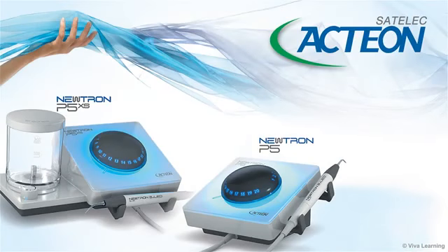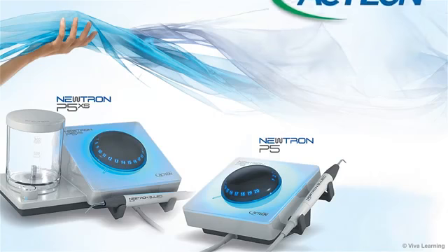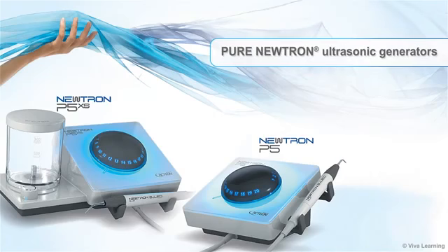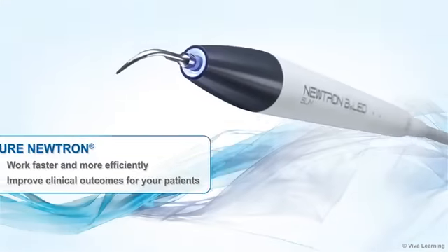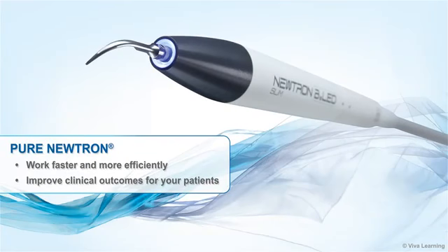Acteon Satelec once again revolutionizes dentistry by introducing a brand new range of pure Newtron ultrasonic generators. Featuring the Newtron P5 and P5XS with improved ergonomics and remote control settings, the new generation of pure Newtron lets you work faster and more efficiently while improving clinical outcomes for your patients.